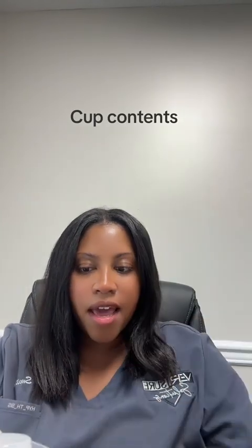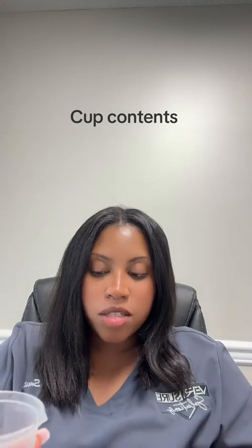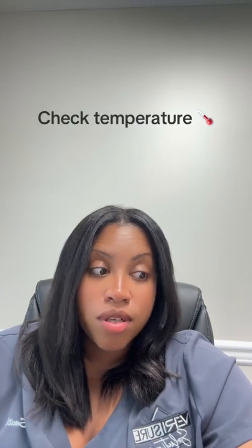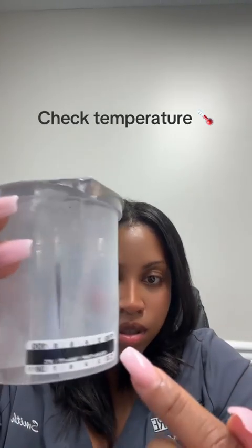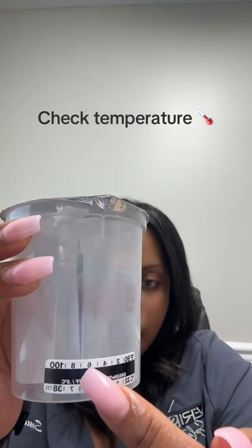And this is what's inside the cup. It's a specimen bag, and then 2 split cups for the actual specimen that you're going to pour, and then this is what the donor will use the restroom in. Once the donor is done, they're going to come outside, provide the sample to you, and sit it down. You're going to check to make sure that the temperature is in range, and there will be a temperature strip where you can read it to say if it's in range or not.